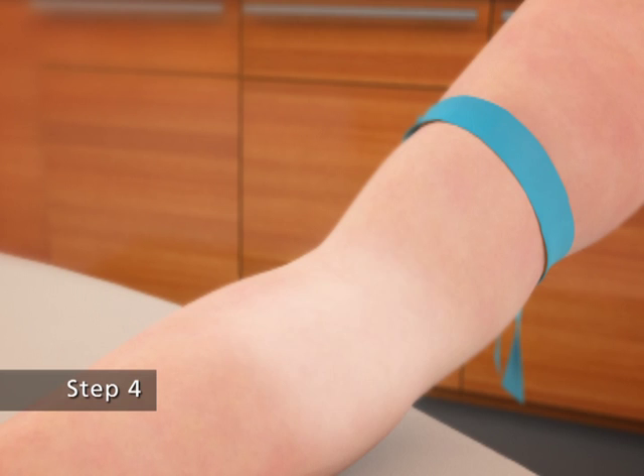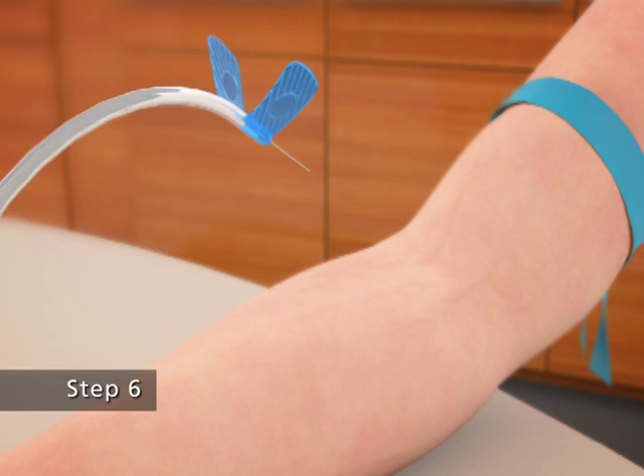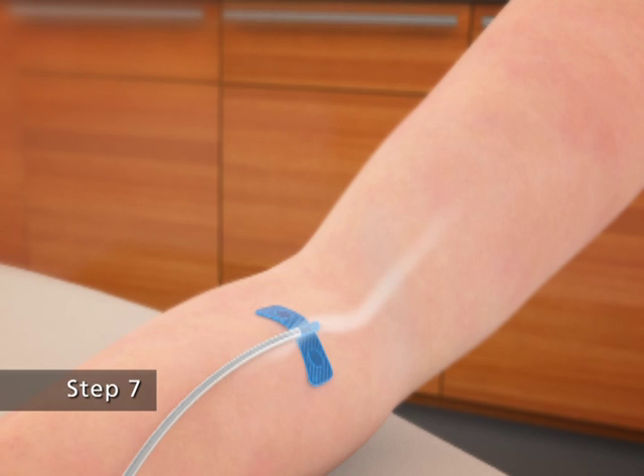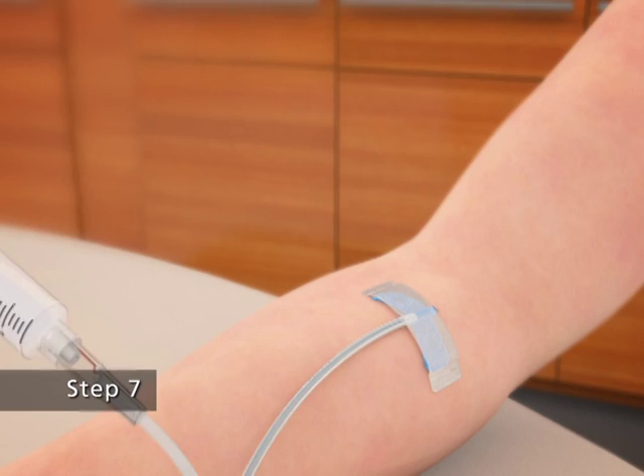Step 4. Apply a tourniquet above the site of the injection. Step 5. Prepare the injection site by wiping the skin well with an alcohol swab. Step 6. As instructed by your health care provider, insert the butterfly needle of the infusion set tubing into your vein. Step 7. Remove the tourniquet and make sure that the needle is in a vein. To avoid needle movement during the infusion, you may want to tape the winged adapter to your skin using medical tape.